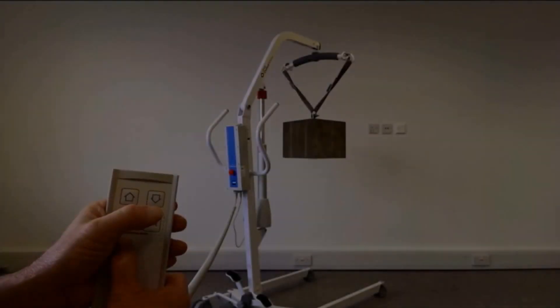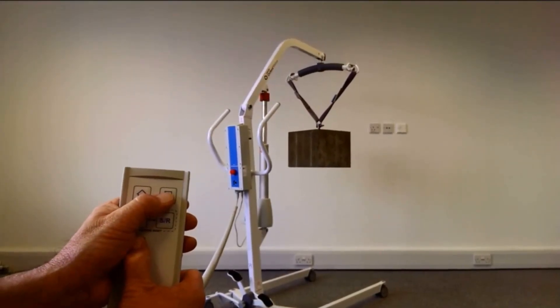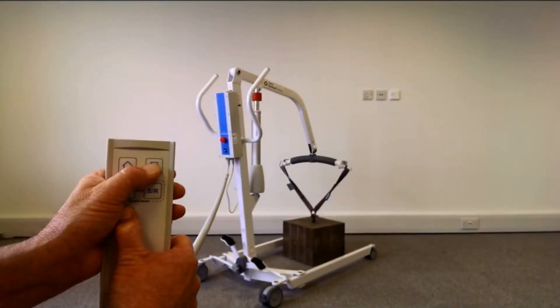With the calibrate button still depressed, lower the boom using the handset until the actuator reaches its lower limit of travel.